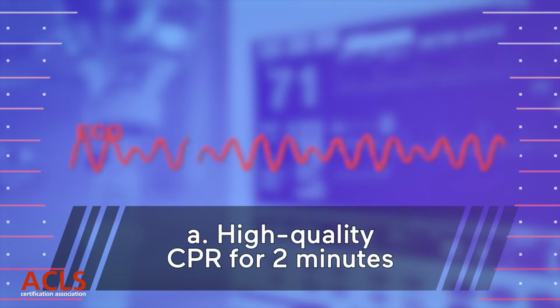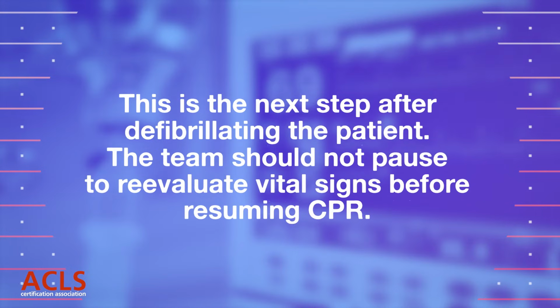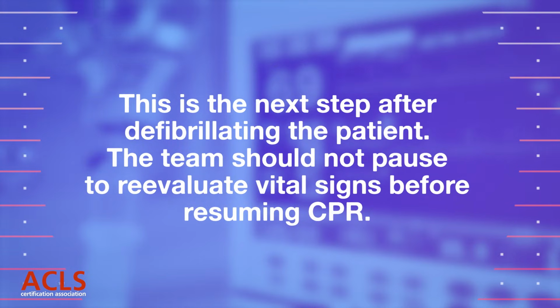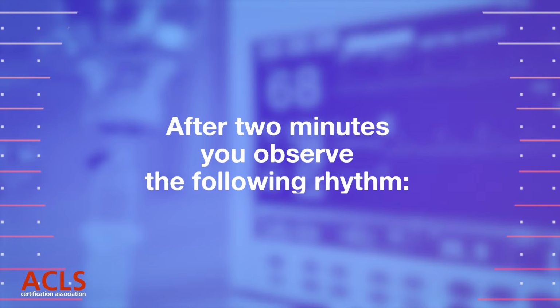Correct answer, A. High-quality CPR for 2 minutes. This is the next step after defibrillating the patient. After performing your previous intervention, you observed the following rhythm.